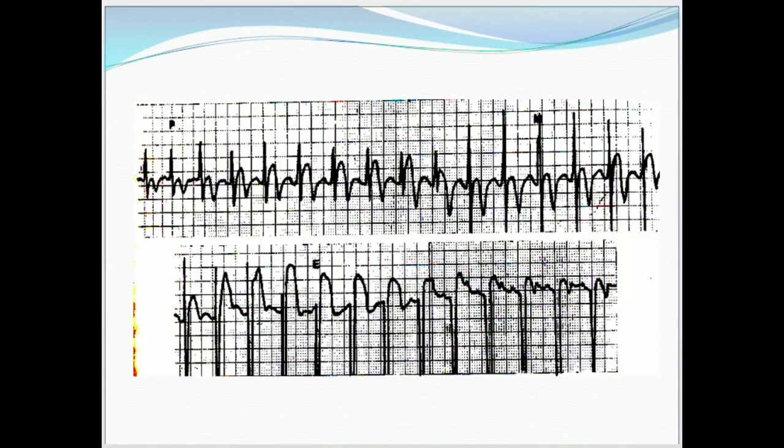You can see in this ECG, every QRS complex has a pacing spike in front of it with ST segment elevation, indicating the ventricle is getting paced. In order to confirm which chamber is getting paced, it is mandatory to obtain a 12-lead ECG.